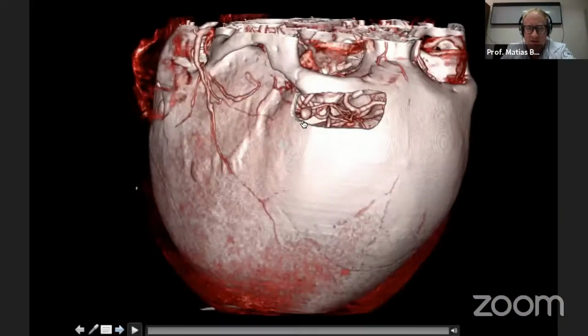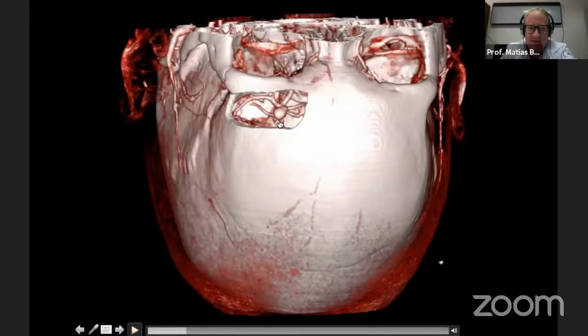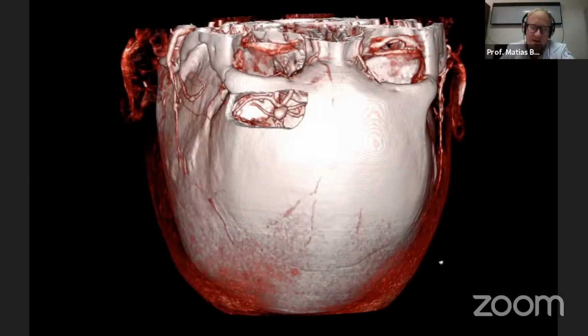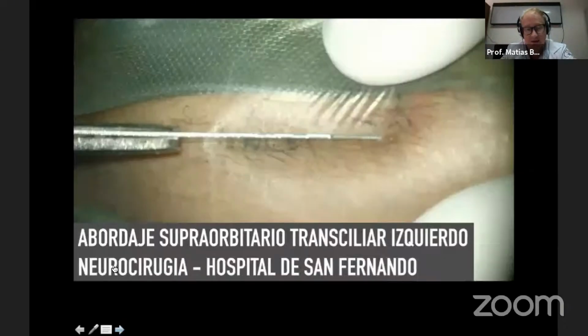The patient in the postoperative period, of course, the cosmetic results were good. The frontalis muscle was perfect too. And the last case I want to show you is this carotid bifurcation aneurysm. We planned the surgery with the angio-CT. It's very important for us in order to reproduce a real scenario like we will have in the surgery.